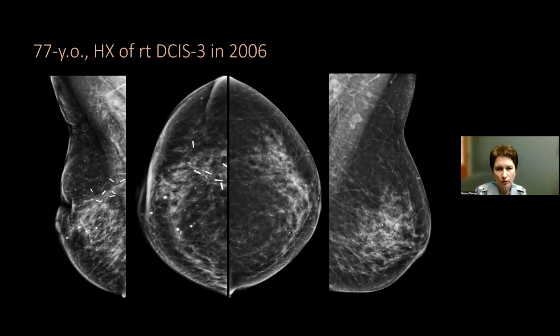And this is her low energy images. So you can see that she has some global asymmetry in the right outer breast. There are a couple of biopsy clips from the prior biopsies. That's what the arrows are pointing to. And this is the area of calcifications that continue to evolve. So there's developing calcifications in that area, amorphous calcifications, but definitely more than before.